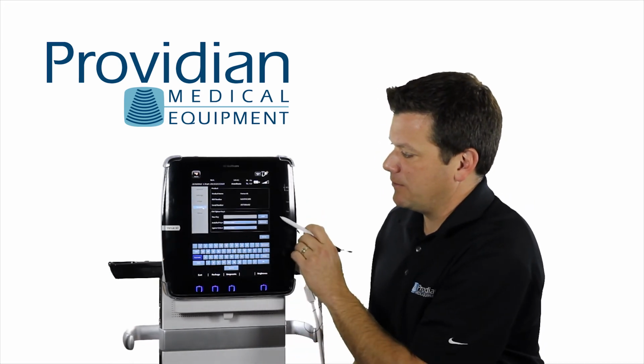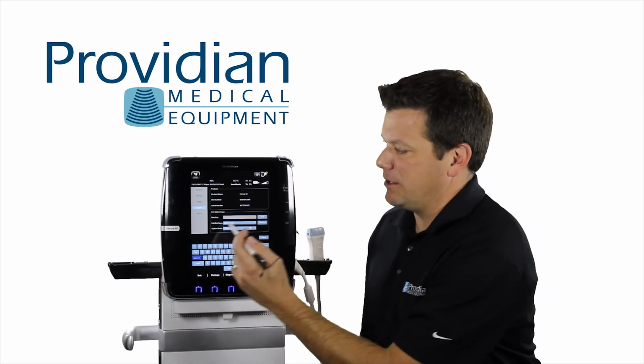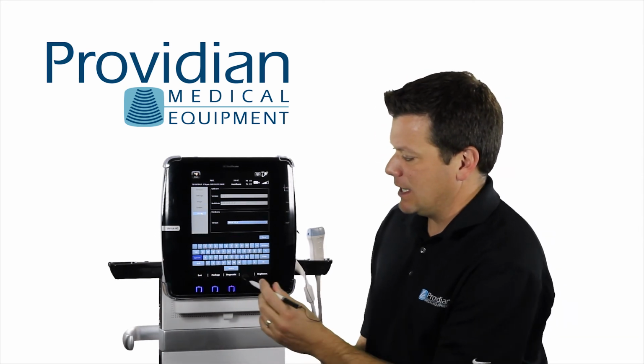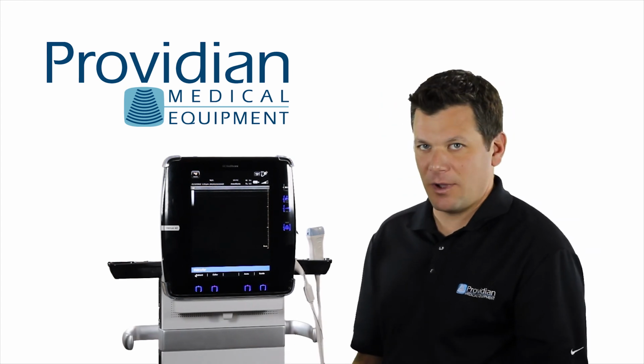System, this is your system information that would be used mostly in a service situation where they would call you and tell you to go through this. And about tells you about your software version of this machine and its install date. We'll go ahead and click exit, and we're ready to go on to the next session.